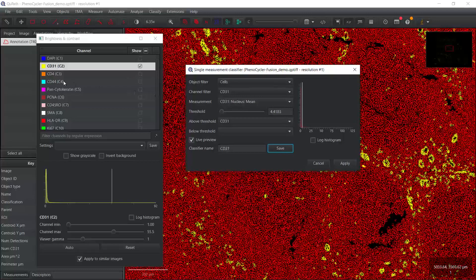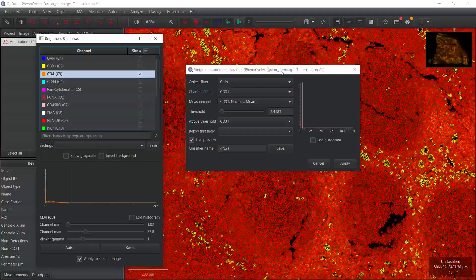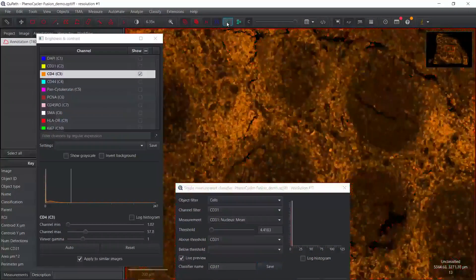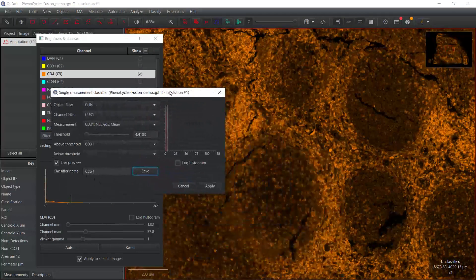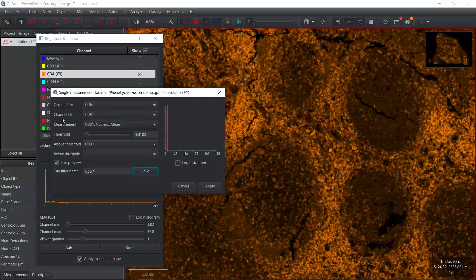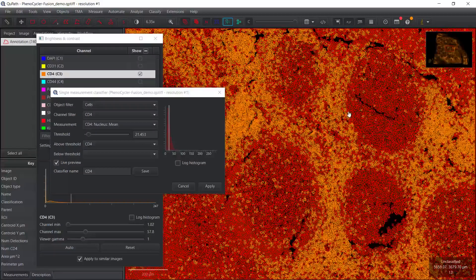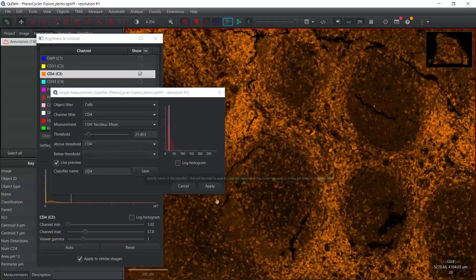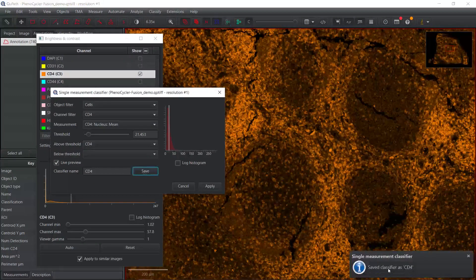Next we can do CD4. We can switch off CD31, then switch on the CD4 stain. Now we can switch off the cell segmentation. You can see the positive staining for CD4. So now we are going to set the classifier for CD4. We need to select the channel as CD4. We already ticked the box for live preview. Now we can switch on the cell segmentation. You can see it is pretty good. It matches to the positive cell staining. We don't need to change the threshold. We can just save this one as the CD4 classifier. You can see we saved it as CD4.